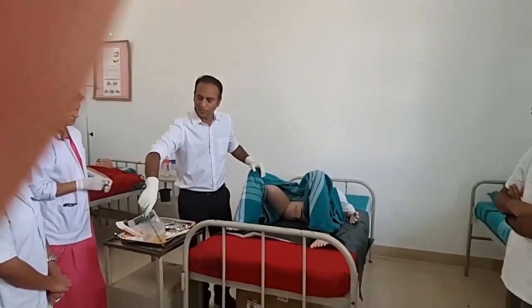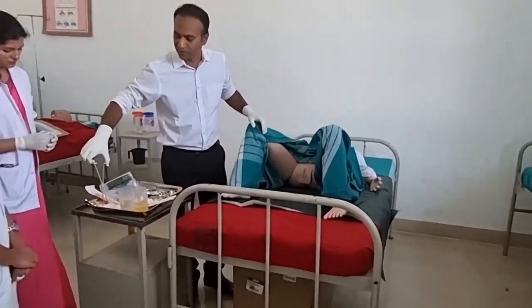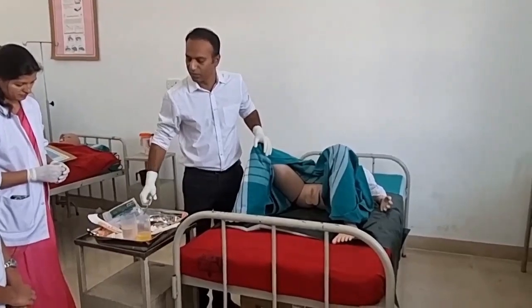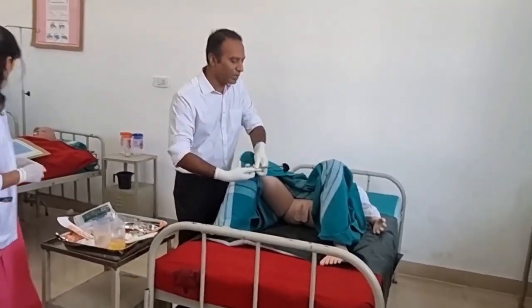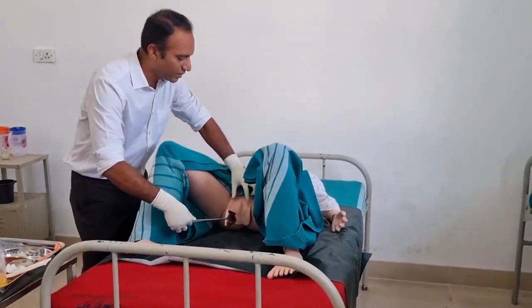With the sponge holding forceps, I'm taking the gauze and dipping it into the betadine solution. A Macintosh is already placed to avoid soiling of the bed.